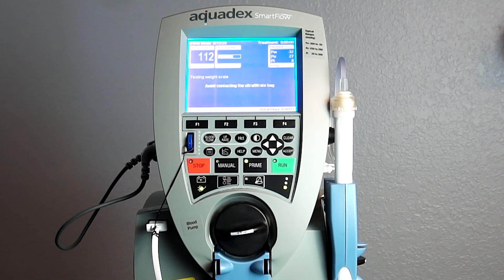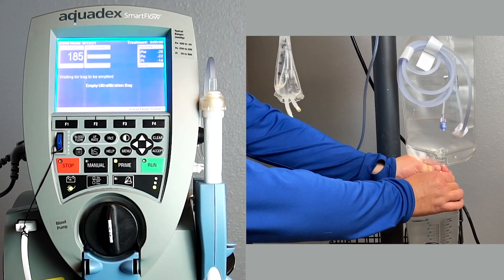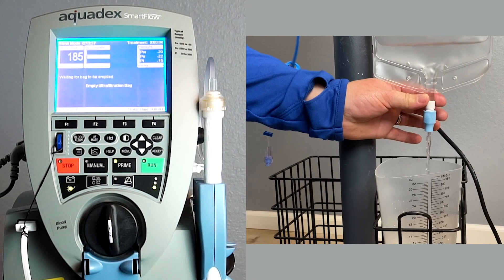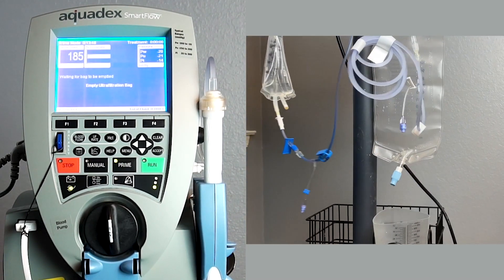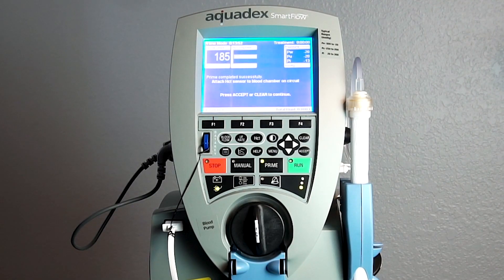Avoid contacting the ultrafiltrate bag during prime. Empty the ultrafiltrate bag, then close the bag drain by rotating clockwise until it is tight. Prime has now successfully completed.